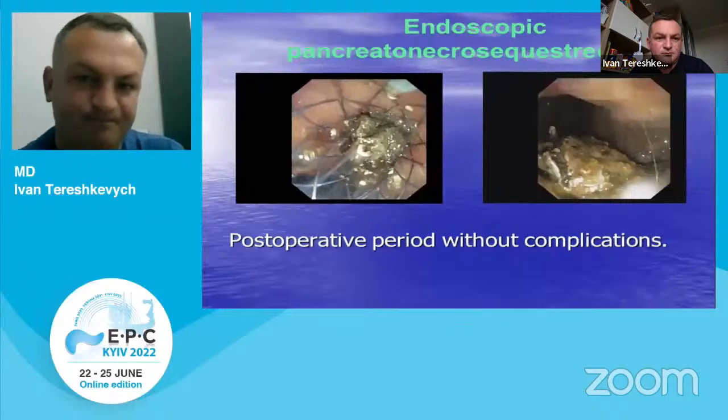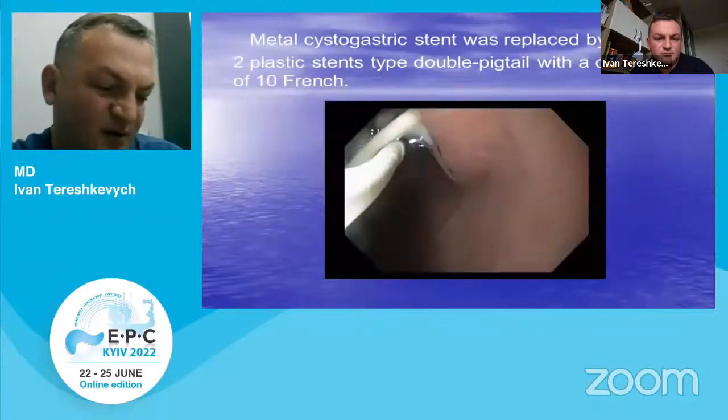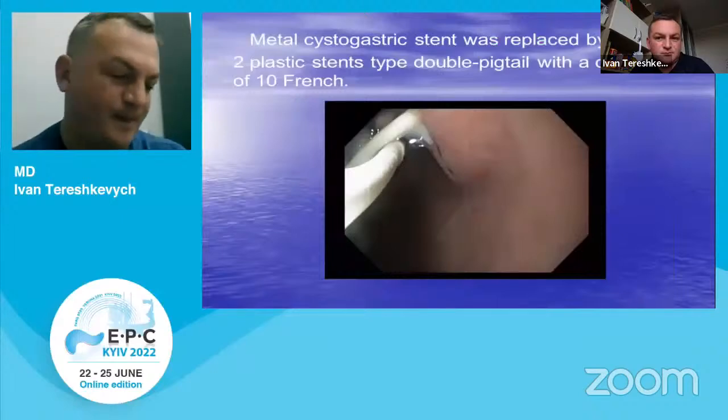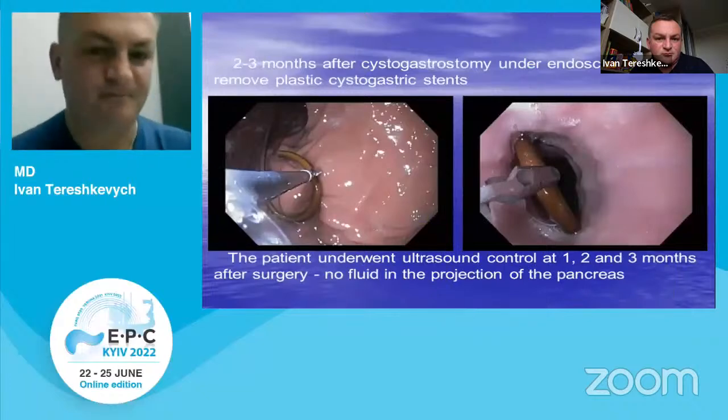The post-operative period was without complications. After complete resolution of pseudocysts, the metal stent was replaced with two plastic ones. These were removed endoscopically.